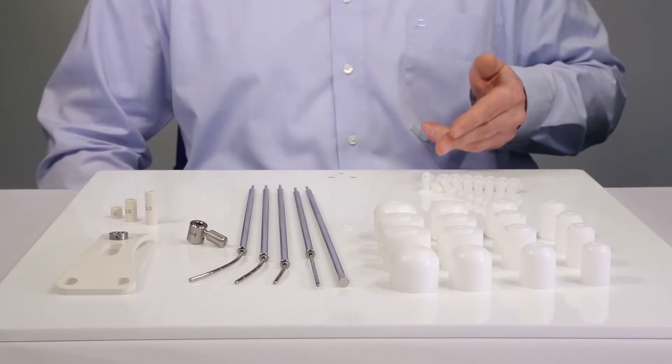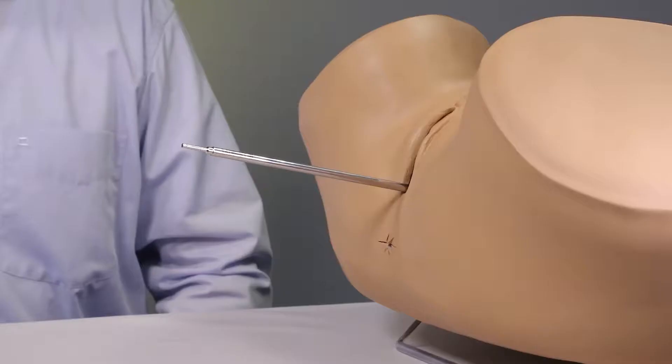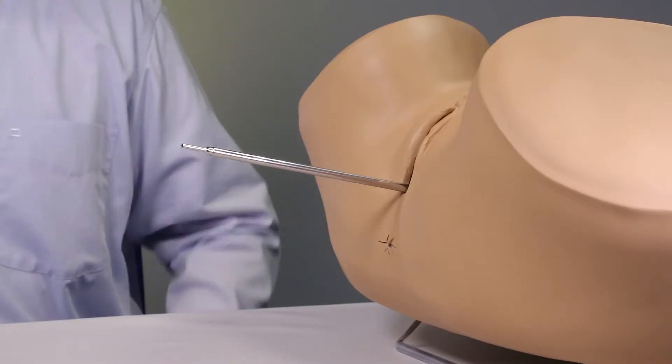Smith sleeves are available as optional items. Let's begin with the insertion using a patient model.